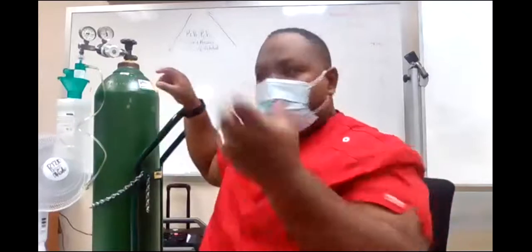But thanks to most modern technology, they now have what's called a blender. We have O2 blenders that simply have a yellow cord and a green cord on the back of it. You put that on the flow meter, turn them on, and there's a knob. Whether you want 40% or 30%, whatever you set it on, it's going to give the patient the right amount of air and oxygen. You don't have to do all this tweaking and analyzing if you have a blender.